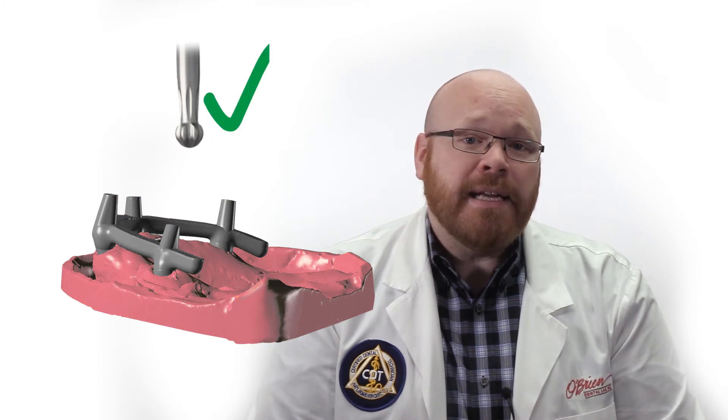That being said, the screws for these abutments do have a unique head which requires a special driver, and you won't be able to torque them without it. Now if you've previously used one of the Atlantis bars with the angled screw channels, those utilize the same driver as these abutments, so you would not need any additional tooling.